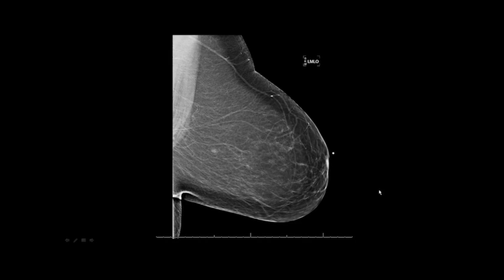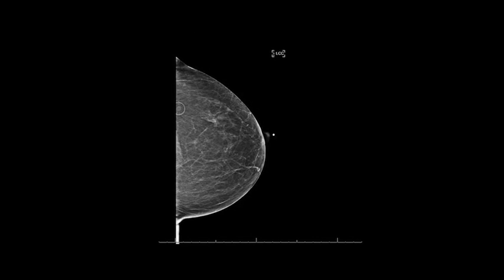Remember, they're going to document something, but that doesn't mean they're going to give you a deficiency letter. So if you get desperate, you're going to pick the best that you have.